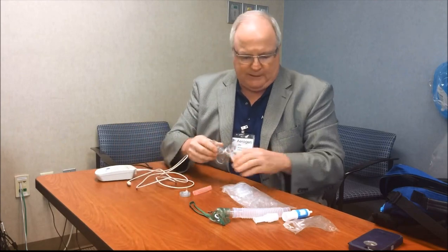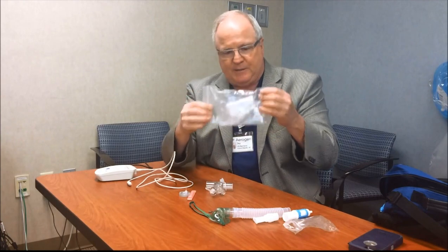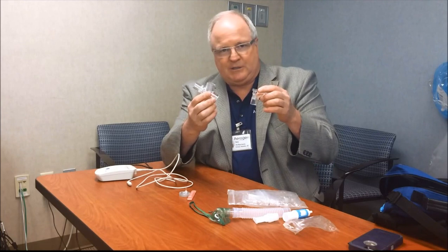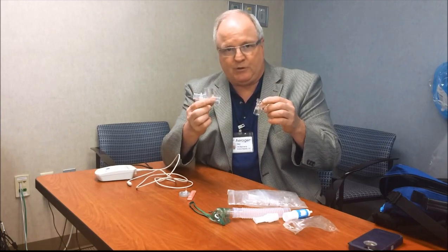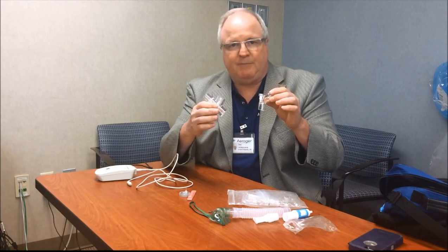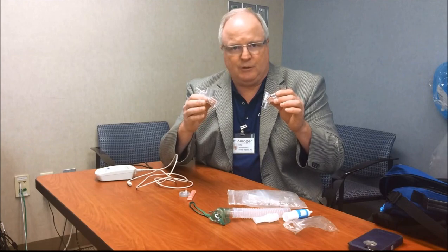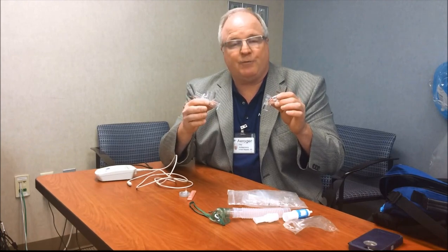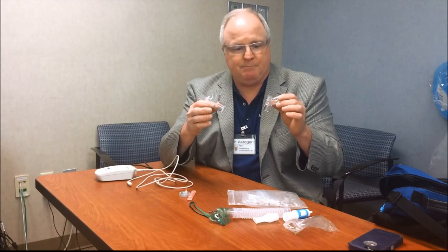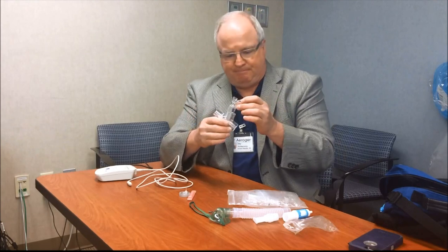So if you look at when you go to do a treatment, you're going to end up having what's called a convenience kit. It will be a Ziploc bag with 3 items in it. 2 of the items are the devices you'll be using. It's a universal T adapter and the Solo nebulizer. Solo basically infers that it's for single patient use, so it's disposed of after you use it for that patient. But it is good for 28 days, so we'll discuss some options in using it post-ventilation. If you use it continuously, it's to be used for 7 days.